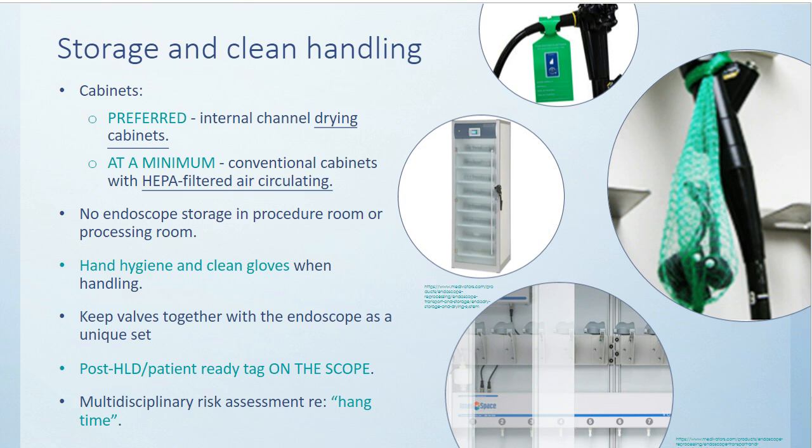As far as hang time goes, or how long a scope can hang in the cabinet before it has to be reprocessed again prior to use, we stuck with our original recommendations, which is a multidisciplinary risk assessment should be performed. And within ST91, we have a lot of information in a chart there to help you walk through what the questions are that you would ask as part of that risk assessment.